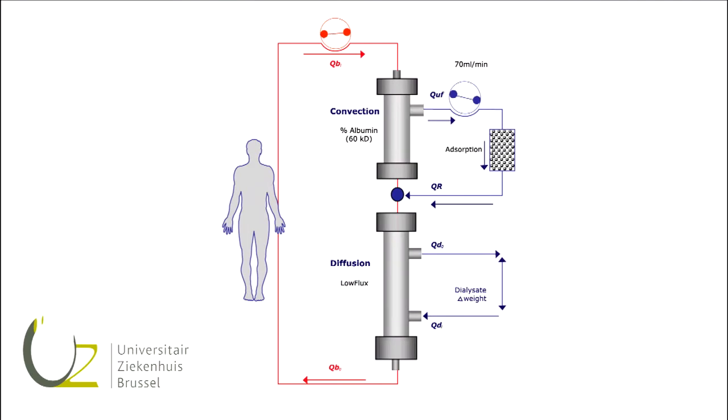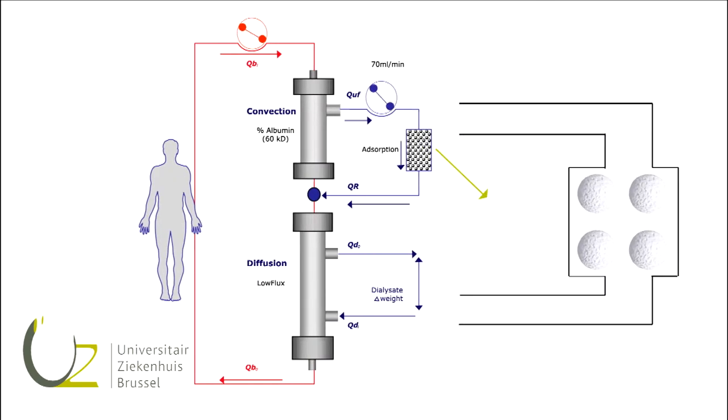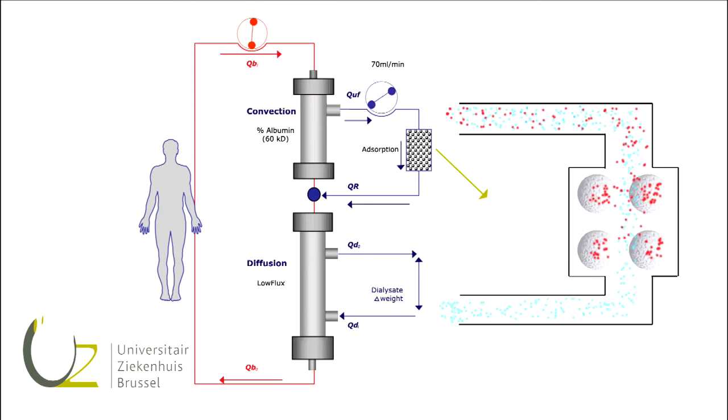The first part is an artificial kidney with a very high porosity, and this allows to get rid of uremic toxins of high molecular weight. Then the blood containing those toxins runs on the second part, a resin cartridge, and the toxins will be adsorbed on the surface of this resin. And then the effluent of the second part runs through a third part, which is a common hemodialysis system. And so we can eliminate the light molecular weight toxins as well as the very high molecular weight toxins. Now we will have a look how it works practically.